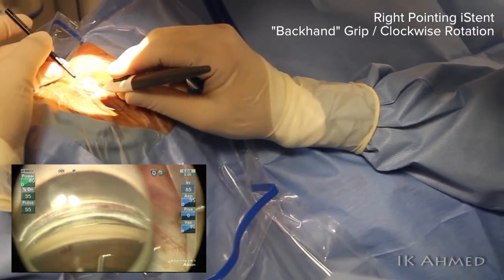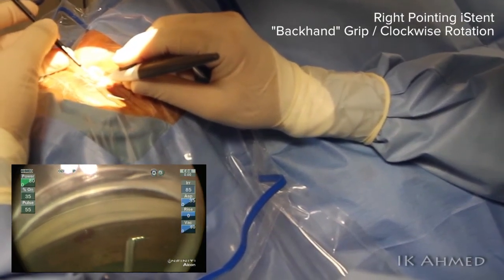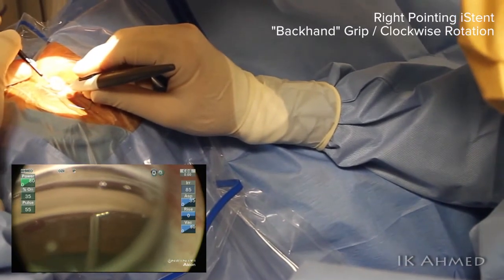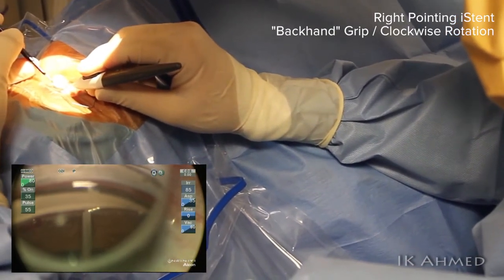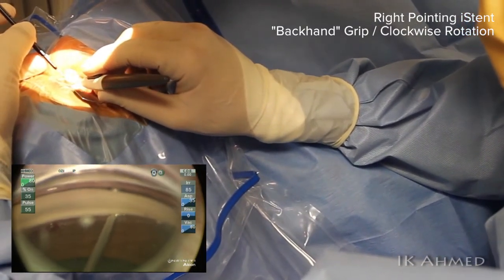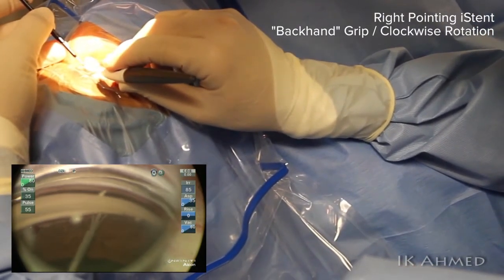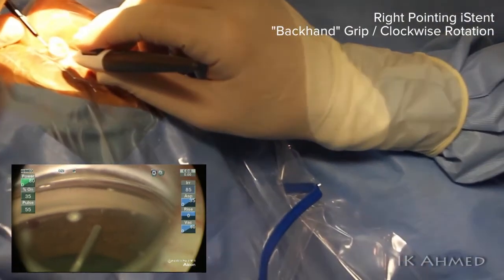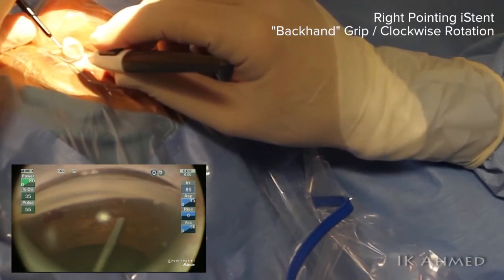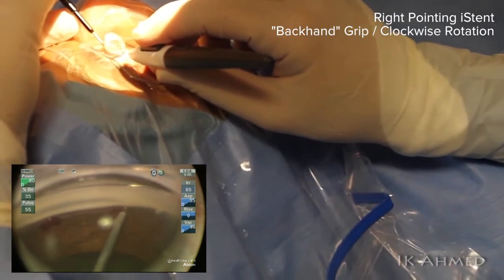This is a very important concept to understand. In this case, we are implanting the device to the right side of the field of view, which enables us to use this right-pointing device in an ergonomic fashion. The approach is again a 30-degree angle. Once we have the tip of the device in the canal, we then acutely rotate our hand about 30 to 40 degrees in a clockwise rotation, as well as pulling the device slightly to allow adequate purchase within the canal without hitting the outer wall. Notice how our hand is rotated in a clockwise fashion; our backhand grip has followed the contour of the angle, differentiating from the forehand grip.